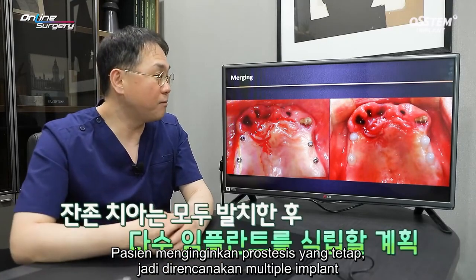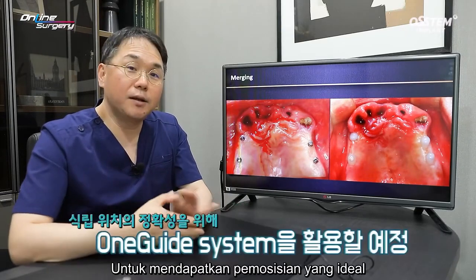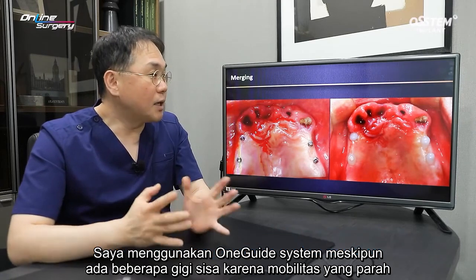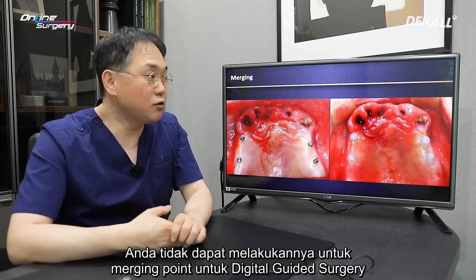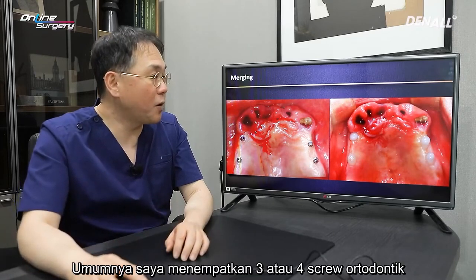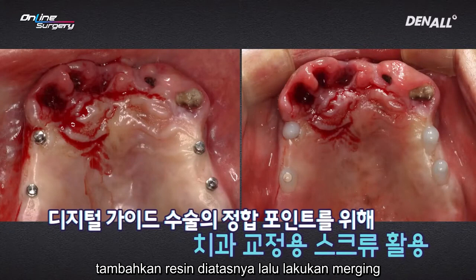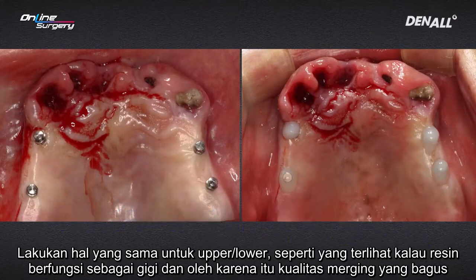The patient wanted a fixed prosthesis, so multiple implants were planned. In order to get ideal positioning, I decided to use the OneGuide system. Although there are residual teeth, because there is severe mobility, you cannot use them as a merging point for digital guided surgery. I normally place 3 or 4 orthodontic screws and add resin balls on top of them, and merging was done in the same way for upper and lower, as shown.